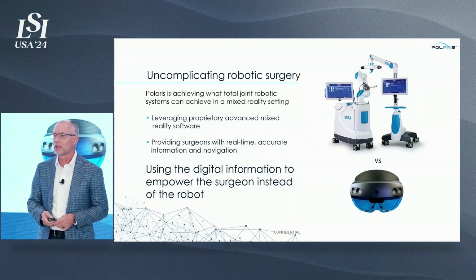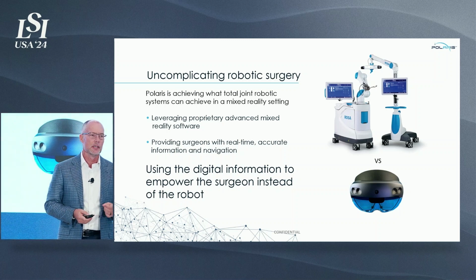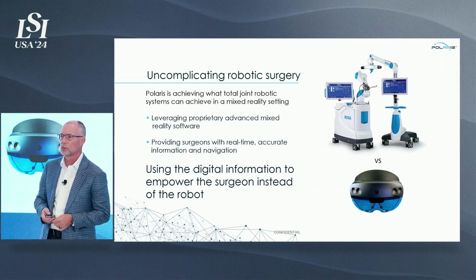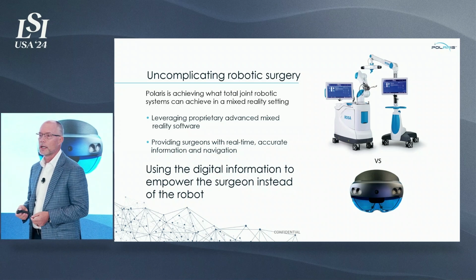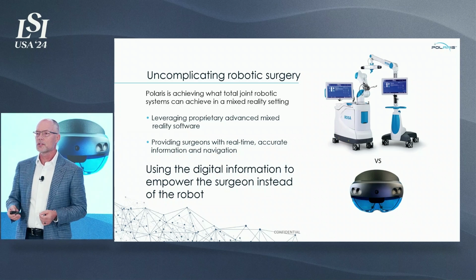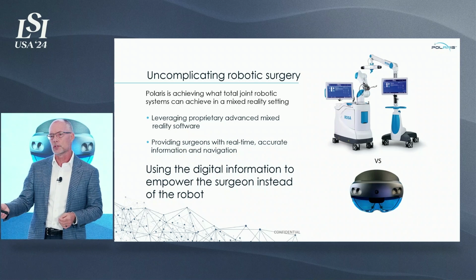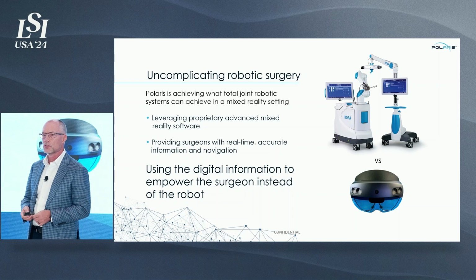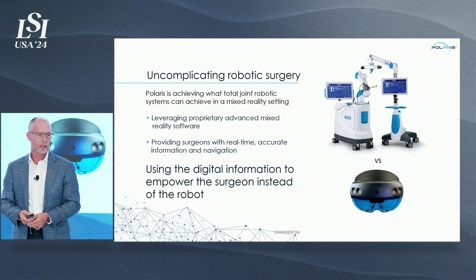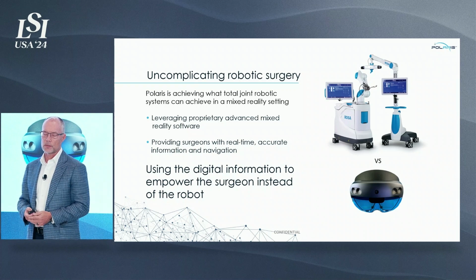The past decade has been a decade of robotics in orthopedics, and in particular, it's been a decade of robotics in total joint arthroplasty procedures, hip, knee, shoulder replacement surgery. The reason why, from our perspective, is because robotics has been able to translate 2-dimensional preoperative plans into 3-dimensional action for the surgeon. So they've been able to take the plan and actually guide it into space for the surgery in a way that allows it to translate into precision.